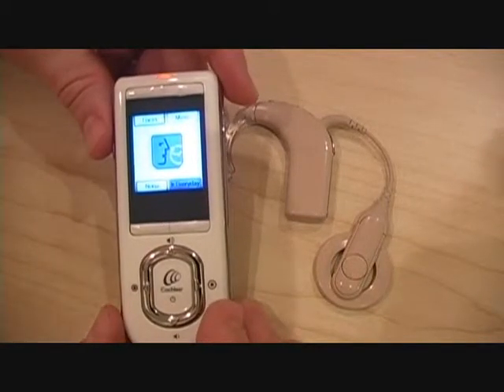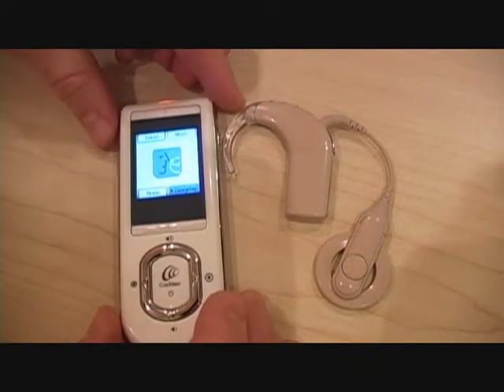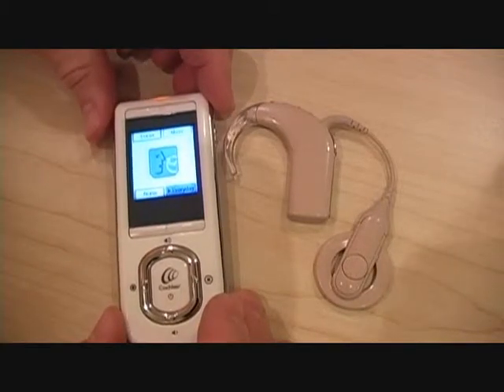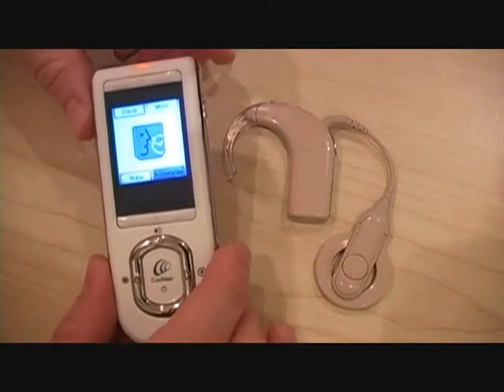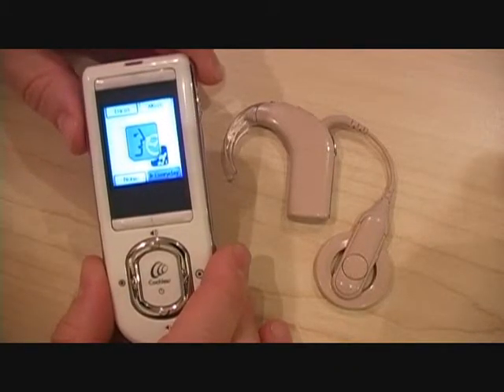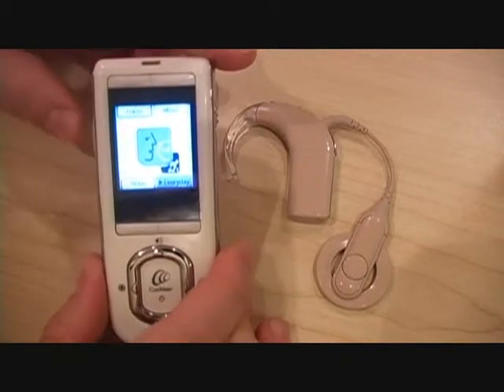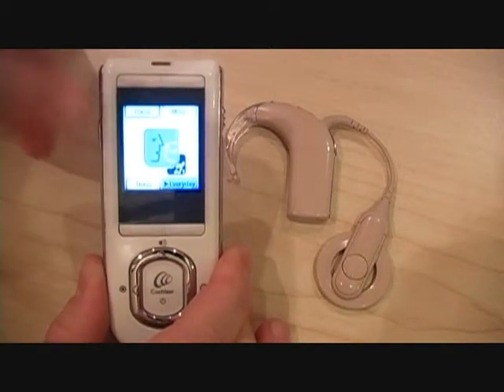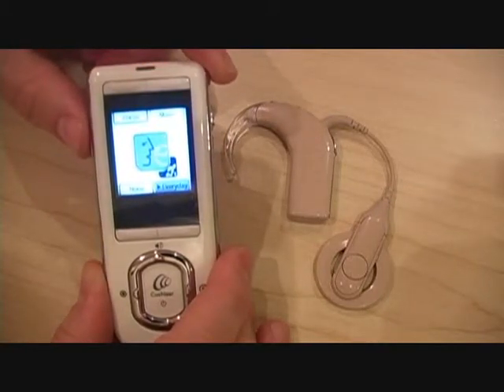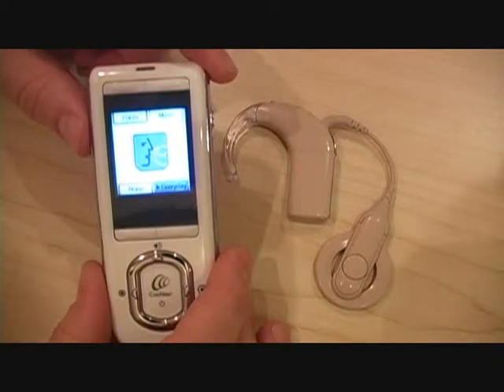If you still do not hear any sound, you'll want to make sure that the telecoil is turned off if your audiologist has programmed one. To do this, check the display of your remote. If you see a symbol with a line through an ear in a black box, you'll want to press the button on the left side of the remote to turn off the telecoil. The telecoil should be activated only when using the phone or when an induction loop is being used.